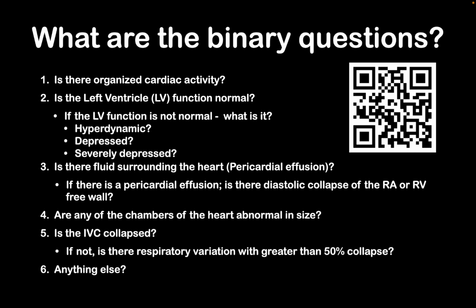I am going to play the exam for you here quickly so that you can at least get an idea of the images before we review them and discuss each of them individually and what they mean for this patient.